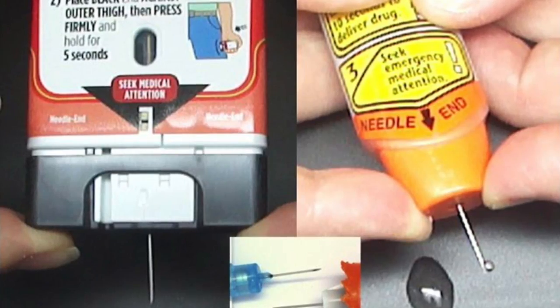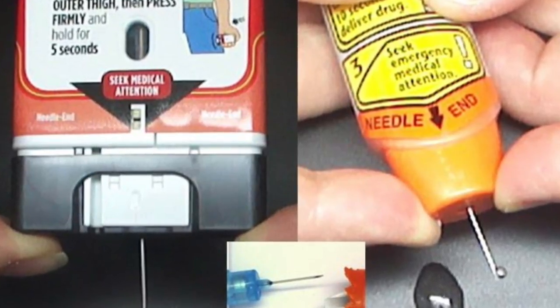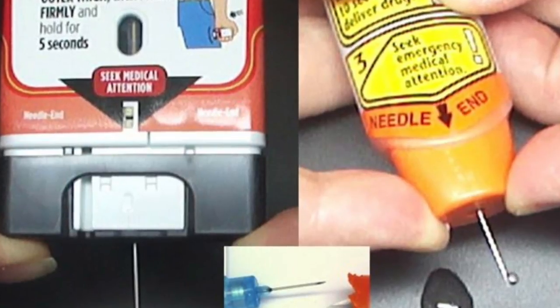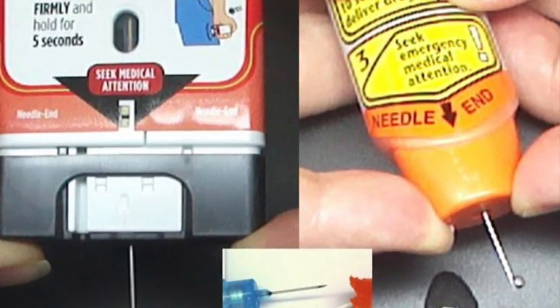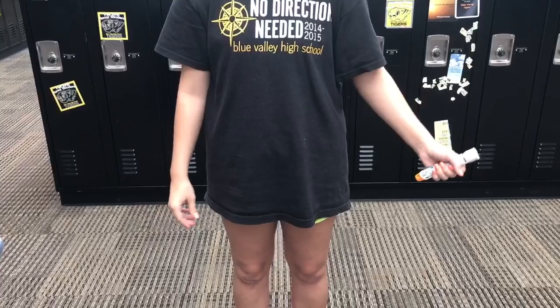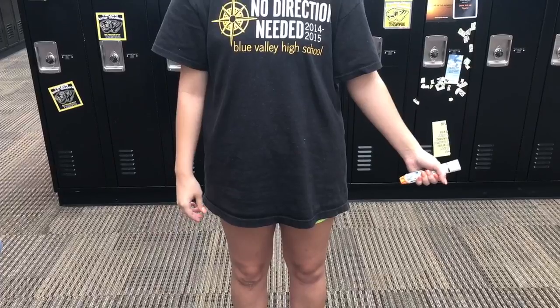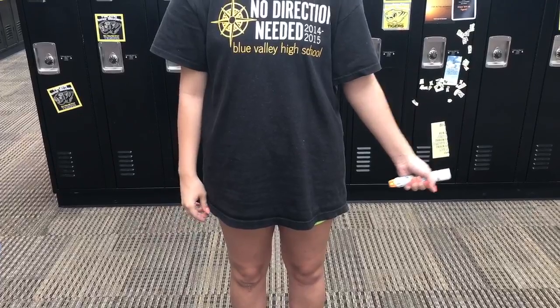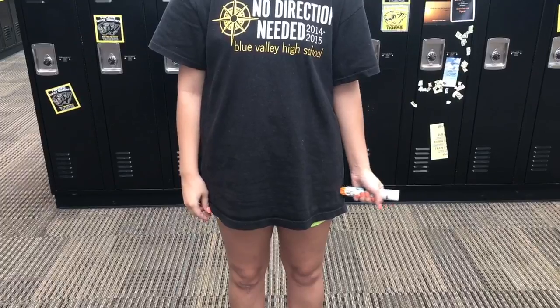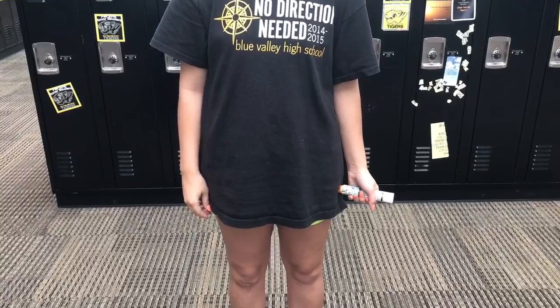Never put your hands near the orange tip because that's where the needle is. If an accidental injection occurs, get emergency medical help right away. The needle is designed to go through clothing but is more effective if inserted into bare skin. The pen should be injected into the outer thigh for quick absorption. Do not insert the EpiPen into veins, hands, or feet because if the medication is not injected intramuscularly, then the rise in blood epinephrine is not as effective.